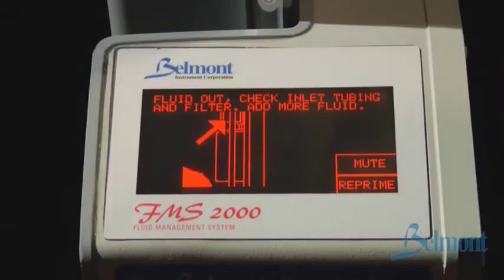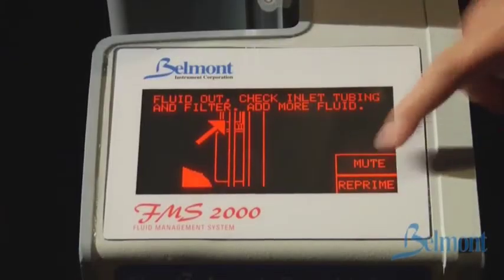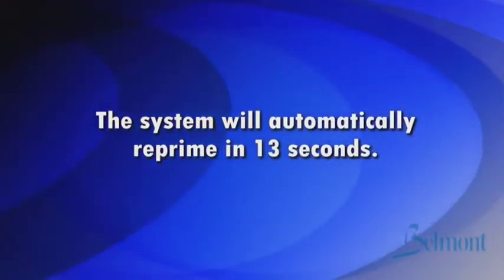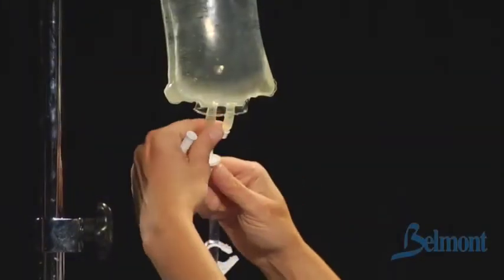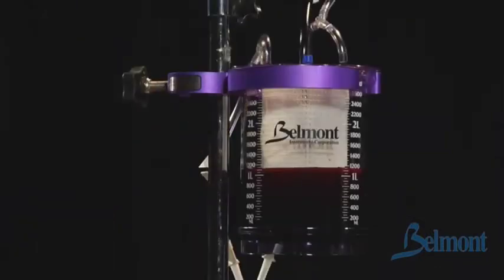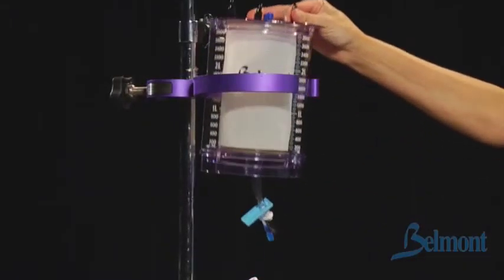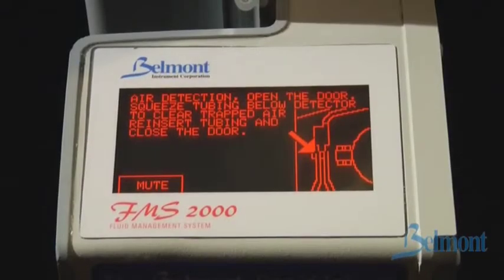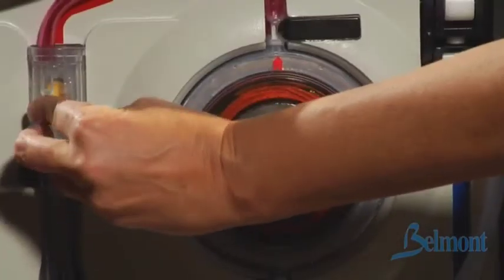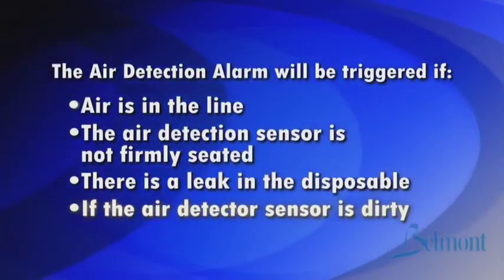An out of fluid alarm will occur if the operator allows the system to run out of fluid. Press mute to silence the alarm, add fluids, and press reprime. The system will automatically reprime in 13 seconds. If the fluid bags are not empty, check that the bags are open and spiked and the tubing is installed correctly. High amounts of particulates in the blood may clog the coarse blood filter in the reservoir chamber. Replace the reservoir chamber or disposable if it is clogged. The air detection alarm will be triggered if air is in the line, the air detector sensor is not firmly seated, there is a leak in the disposable, or if the air detector sensor is dirty.